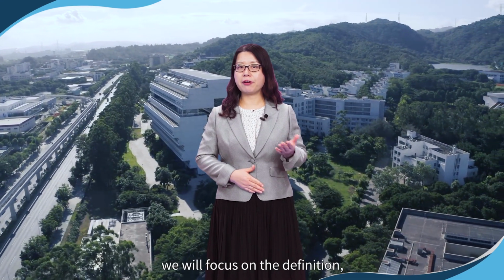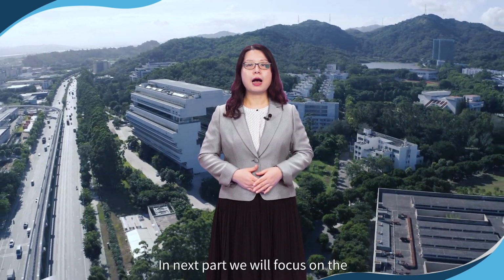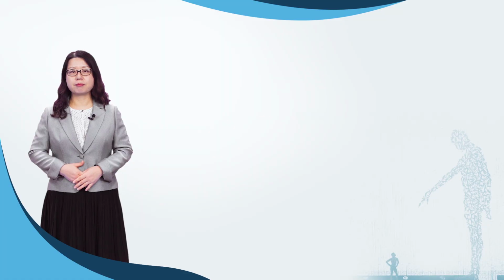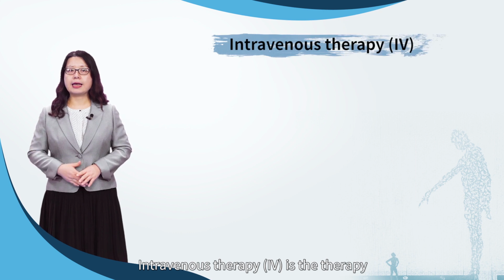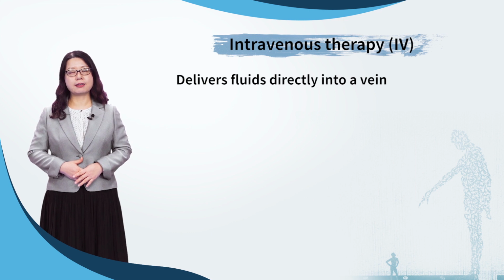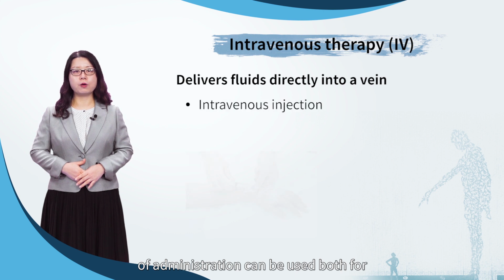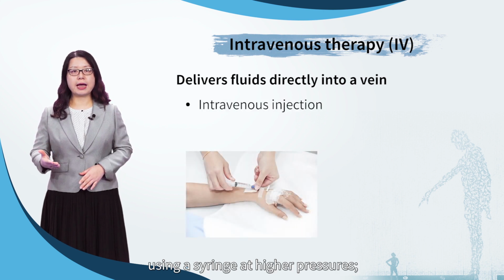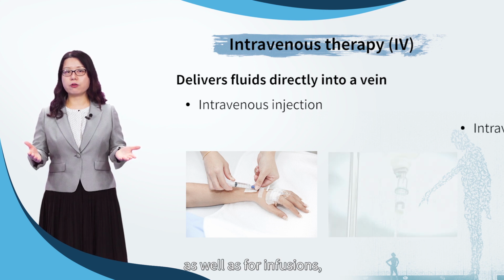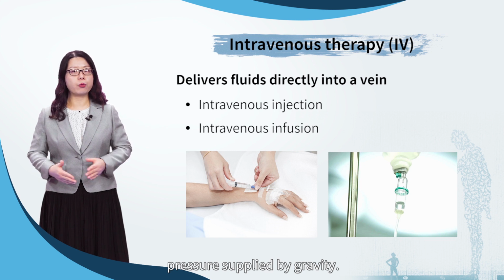In the first part of this session, I will focus on the definition, the purpose, and so on. In next part, I will focus on the implementation of IV. Intravenous therapy is the therapy that delivers fluids directly into a vein. The intravenous route of administration can be used both for injections using a syringe at higher pressure as well as for infusions, typically using only the pressure supplied by gravity.